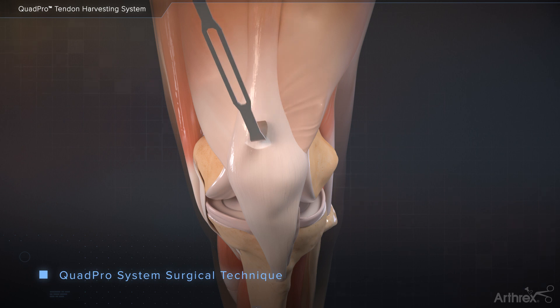Identify the VMO and stay lateral to this landmark. Advance the scope proximally until the musculotendinous junction of the rectus femoris is visualized. Turn the lens of the scope toward the skin so the light can be seen through the skin. This is the proximal limit of the graft and marks the direction of the graft harvest. Mark the skin at this point for reference.